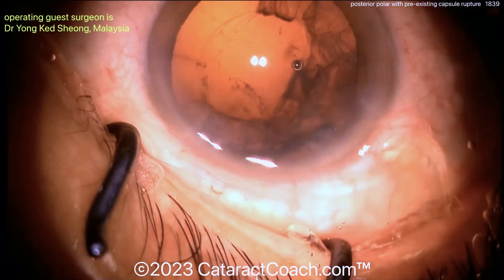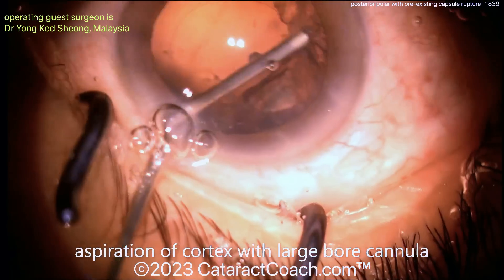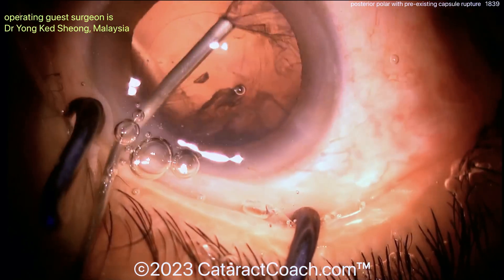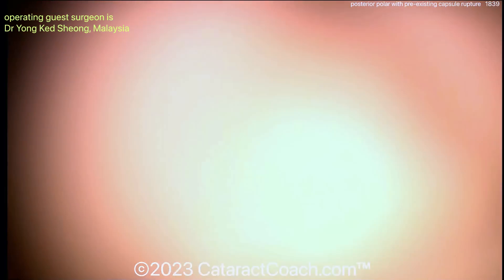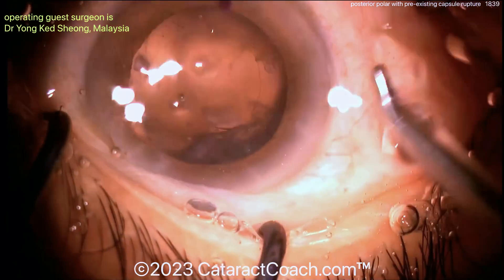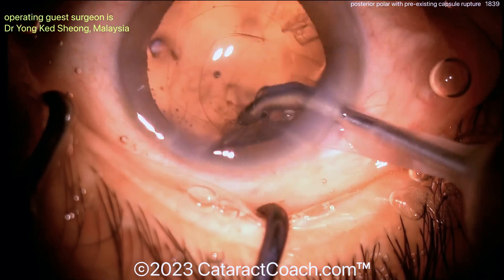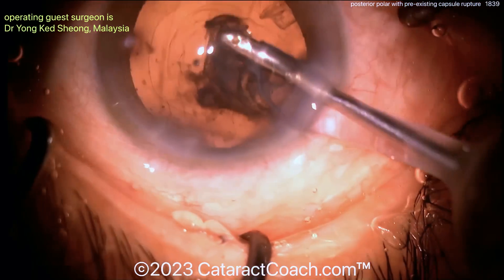For the lens, yeah — definitely do a three-piece lens here because you have a posterior capsule defect. Good use going through the side port, now using a larger bore cannula to manually aspirate that out — that's a good way of doing it too. Plenty of dispersive viscoelastic already inside the eye. You can even make another paracentesis incision if you need to, and you can avoid vitreous prolapse in this case.